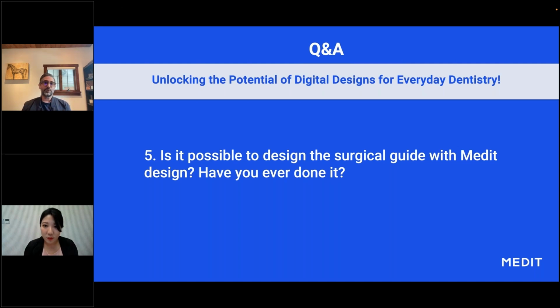But with that said, you can design it. At the moment, you'd be designing a surgical guide that doesn't necessarily have sleeves for the different implants, though that may be coming in the future. For now, you'd be designing a simple surgical guide that gives you the orientation and location, but without actually having the digitally planned implant there, and you can do it.